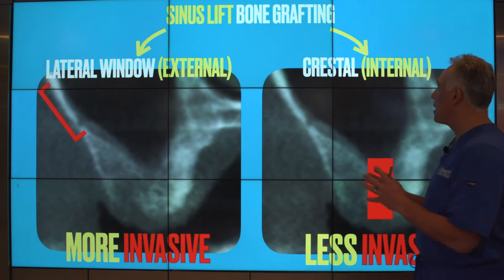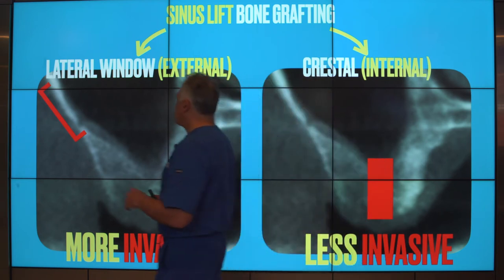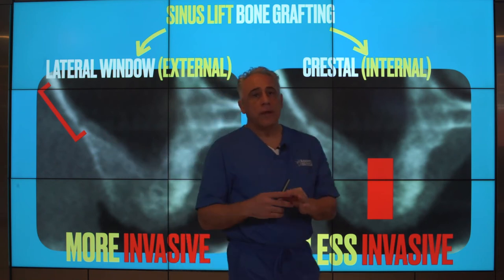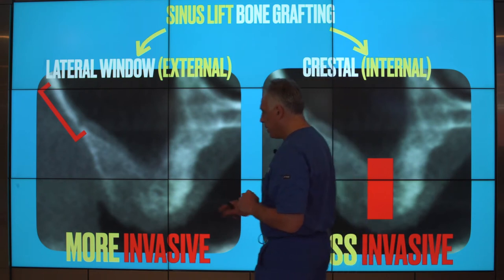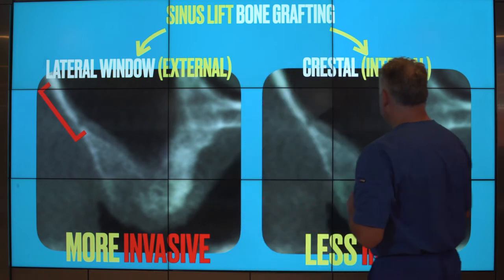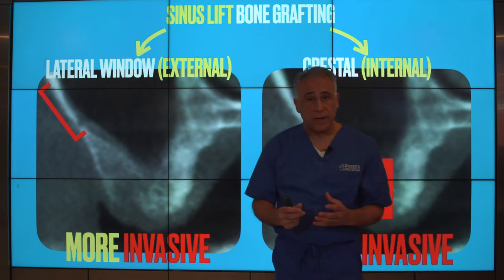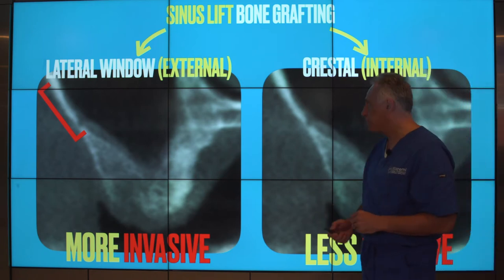Now, there are two types of sinus lift bone grafting techniques. There is a conventional technique known as lateral window, and this is also known as external. With this technique, a window is created on the outer side of the jawbone with access to the sinus area to elevate the sinus membrane and perform the bone graft. And this is considered to be more of the invasive approach, conventionally and traditionally thought of. The second approach is known as the crestal approach. This is an internal approach where essentially an access is created in the area where the implant is going to be placed, and this is considered to be a less invasive technique.